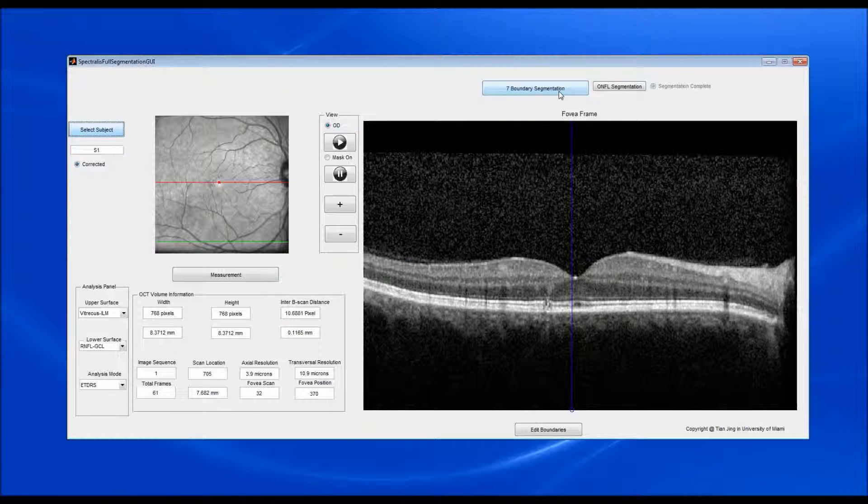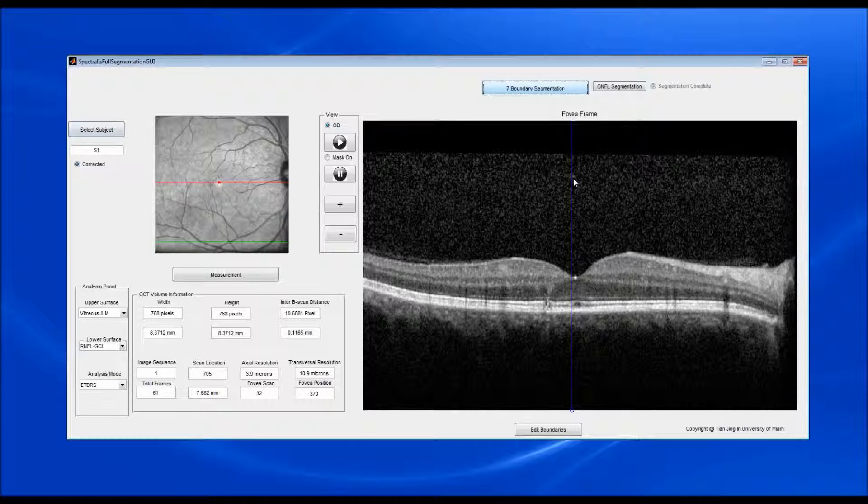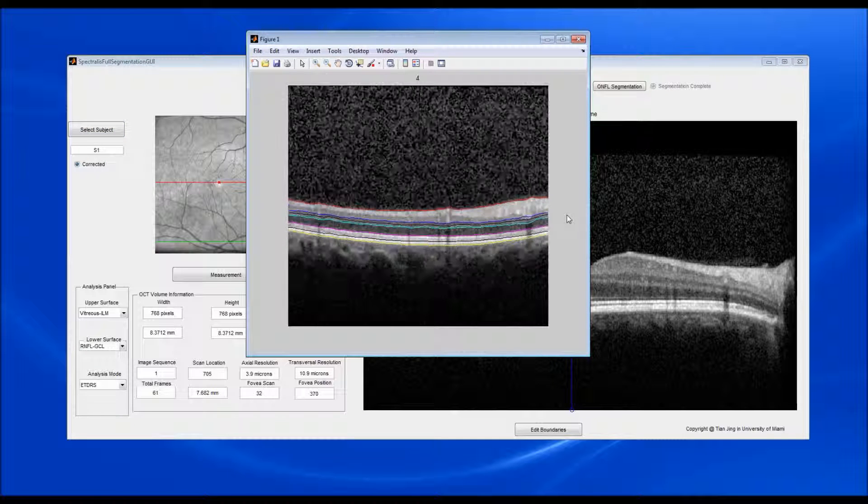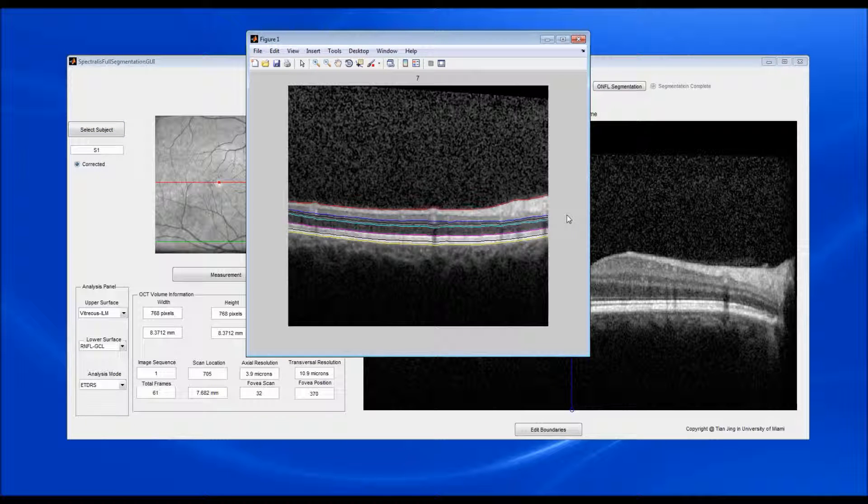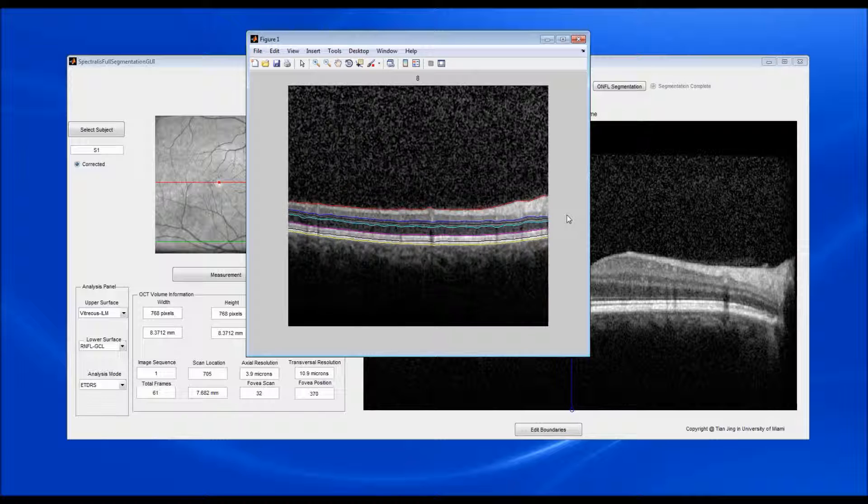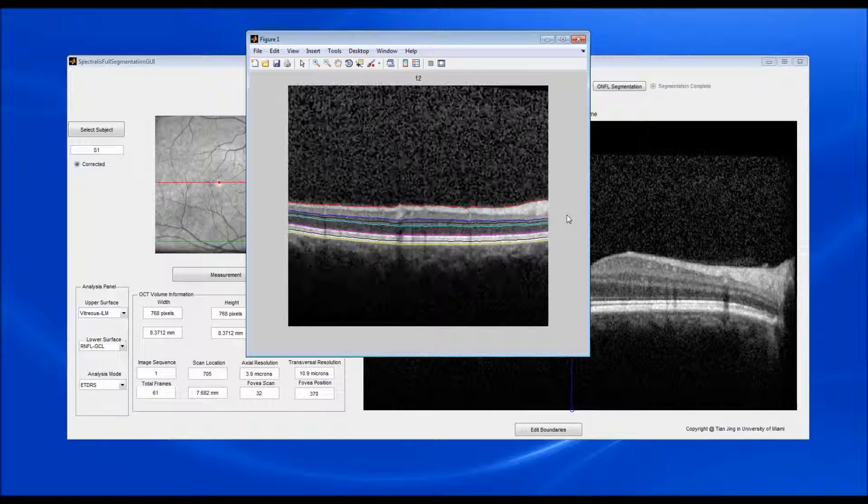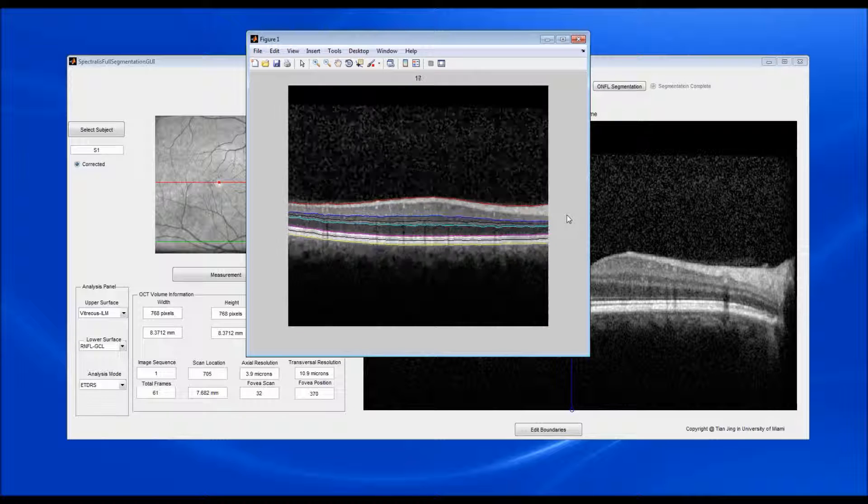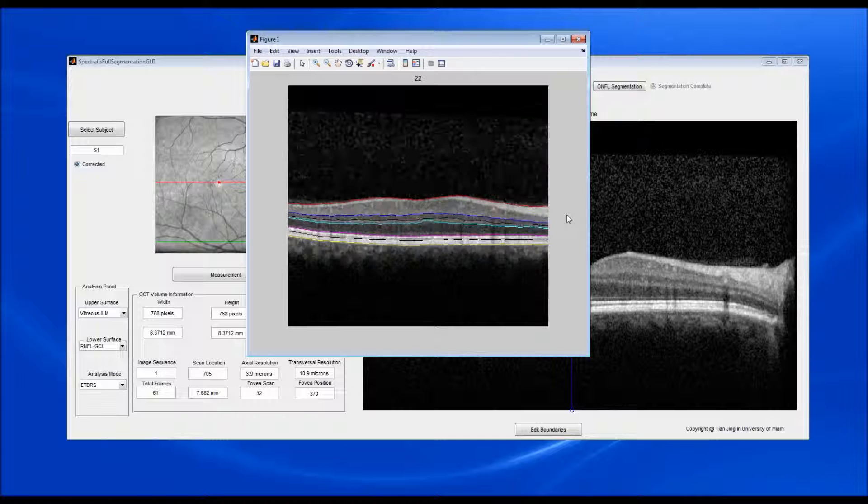Click on the Segmentation button. The retinal layer boundaries, except the outer boundary of the RNFL from the 6x6 mm region around the fovea, are segmented now.